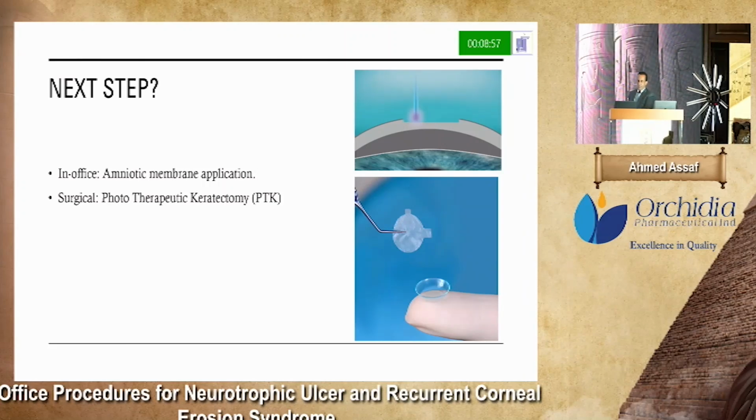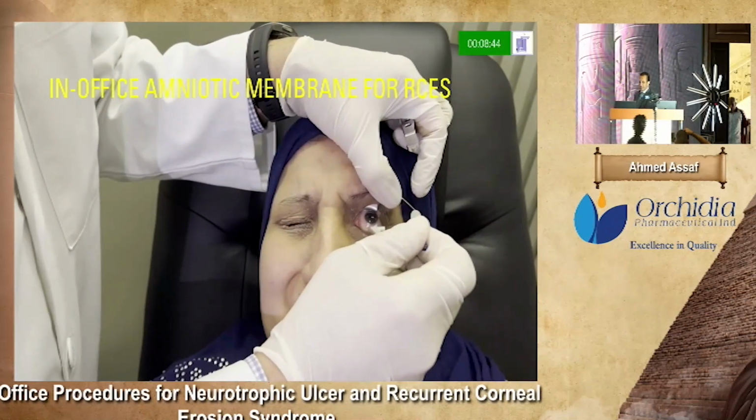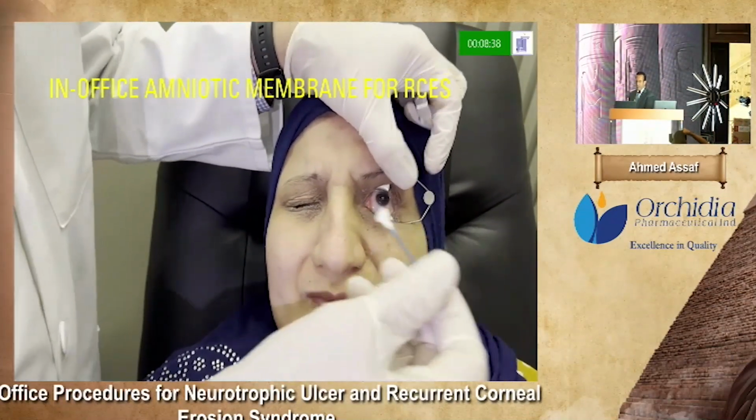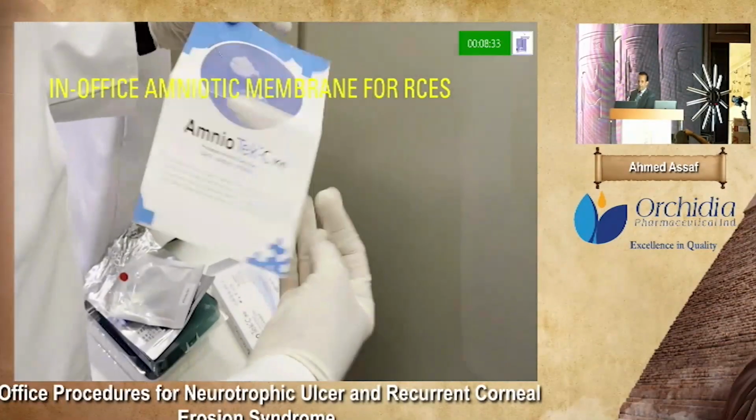Next step, either we can go for aggressive treatment like PTK, phototherapeutic keratectomy, or we can have something like in-office amniotic membrane application. So I opted for amniotic membrane application. We have to do some debridement of the corneal epithelium first by dry weck cell, and then we can apply the amniotic membrane that comes in dried format.